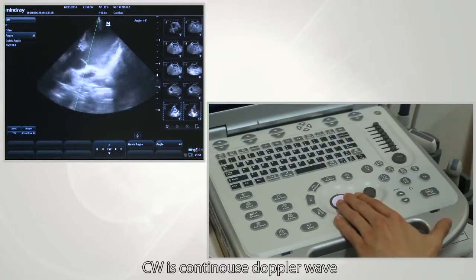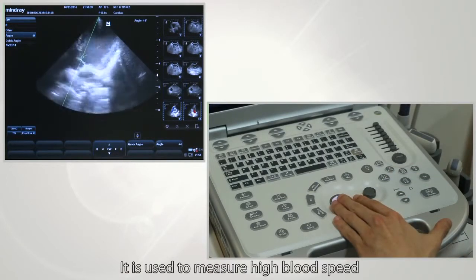CW is continuous wave Doppler. It is used to measure high-speed blood flow.